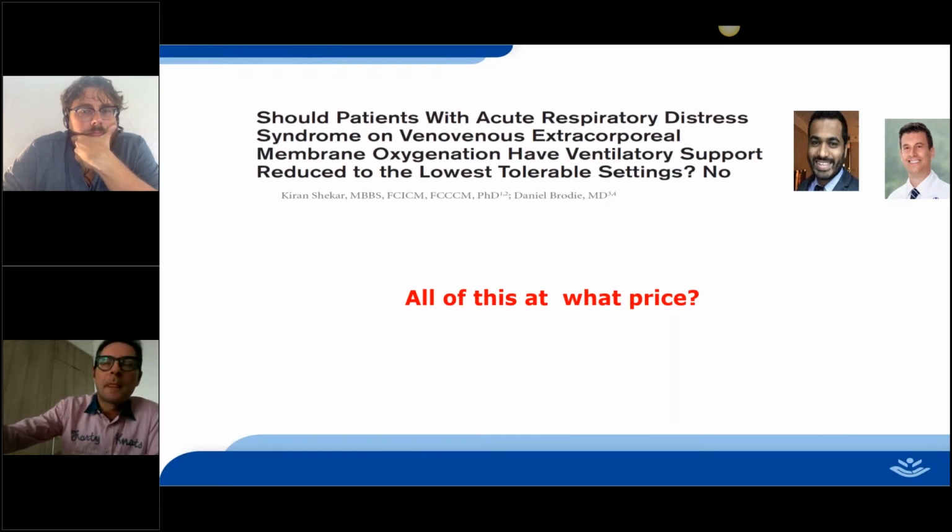because we have no other arms to come out from ECMO. Another important aspect is that to maintain a patient fully dependent on ECMO, we must have an ECMO system that works perfectly. And in particular, we must have a lot of flow. In children, sometimes it's very difficult to get the flow that we want, mainly for cannula reasons. Sometimes we do not have the cannula that we want, the cannulation is not going well. So the problem of flow is very, very important.